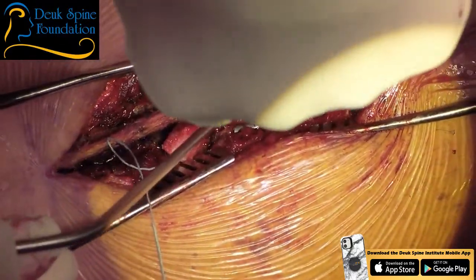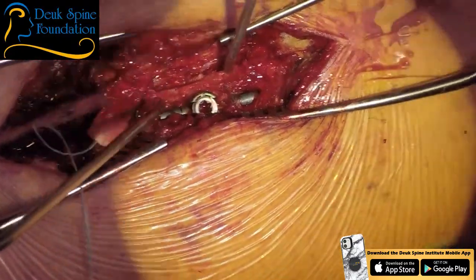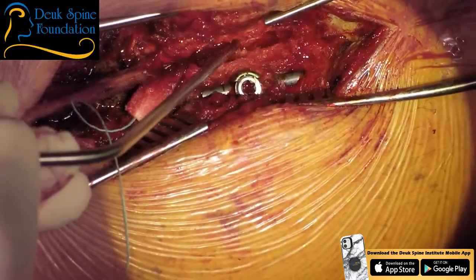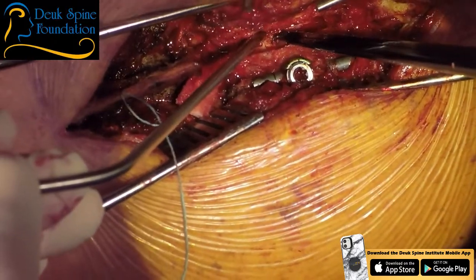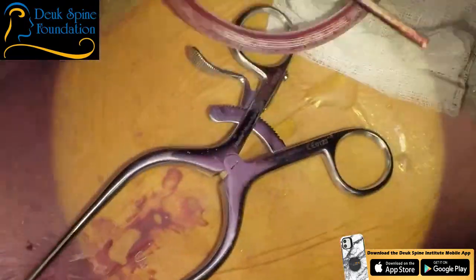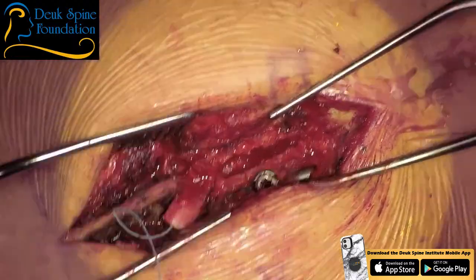All right, let's just get a Kerrison 2. And I'm going to do a fusion as well, an onlay, hopefully to stabilize it a little bit so we don't have to come back. But I'm not going to use screws and rods. Oh, that little bit left right there I've got to get. It's kind of digging in on the side. I need you to get in there and suck for me. Take this. I need an angled curette.